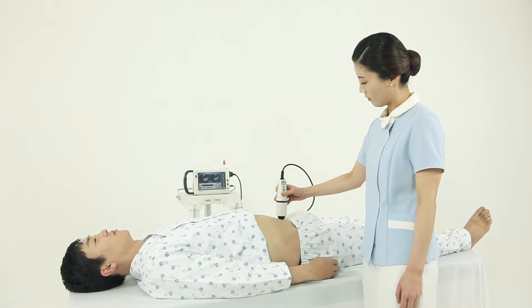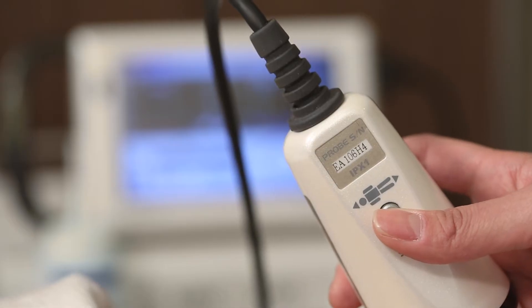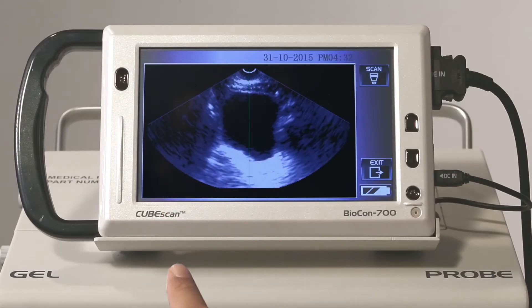Make sure your patient looks at the ceiling in a correct position. Press the scan button on the probe or touch the scan icon on the screen for pre-scan.